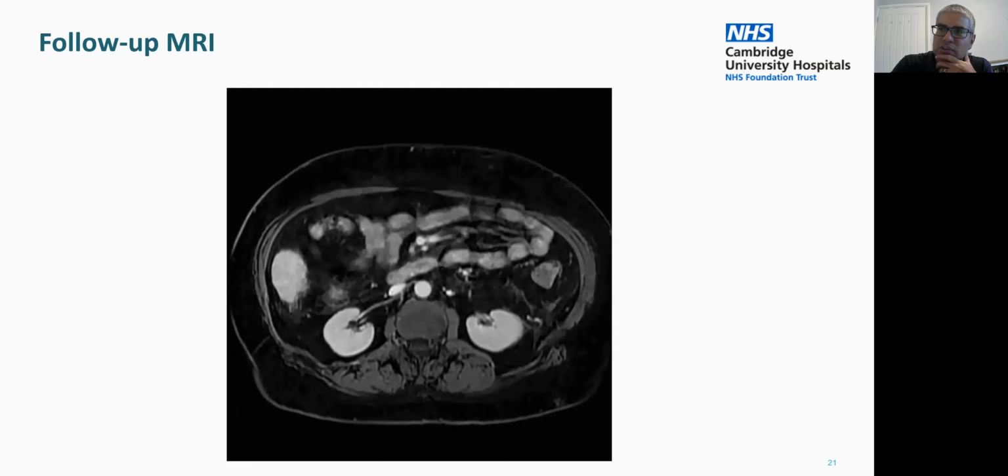And the third thing that struck me about this case was, as I said, we were a bit worried about the top end. It may end up being that you end up doing cases that change your follow-up imaging strategy, that you might change the time interval between doing follow-up scans if you're particularly worried about a particular area.